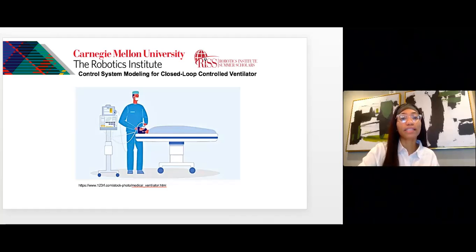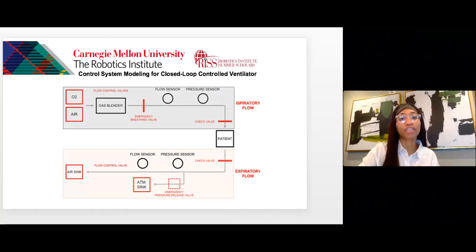The ventilator combines mechanical and pneumatic design with robotic control to form a closed-loop system that can provide positive pressure, forcing air into the lungs and maintaining airway pressure through exhalation. Currently, the device hardware must be modified in order to adjust and test components, affecting parameters such as the volume of air being supplied or the speed of inhalation.